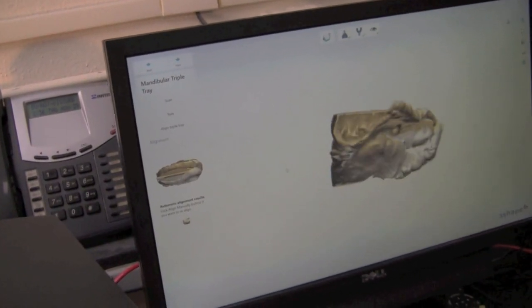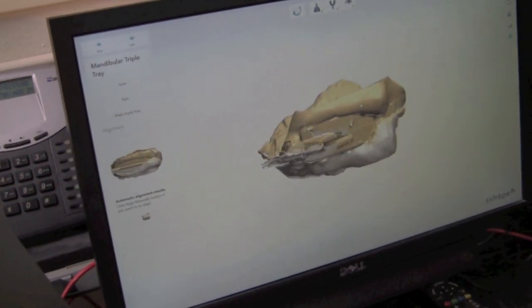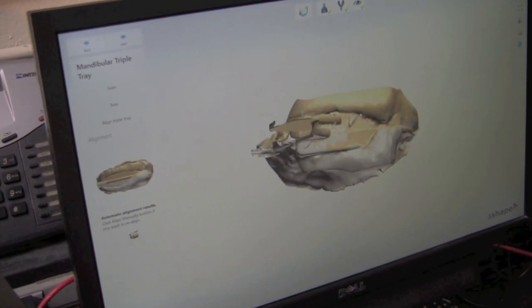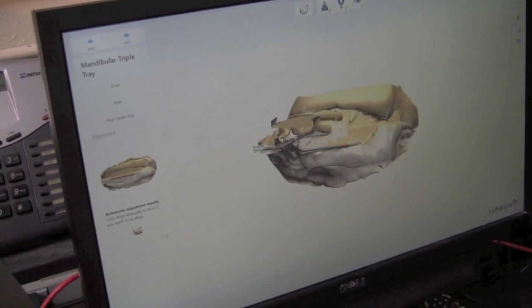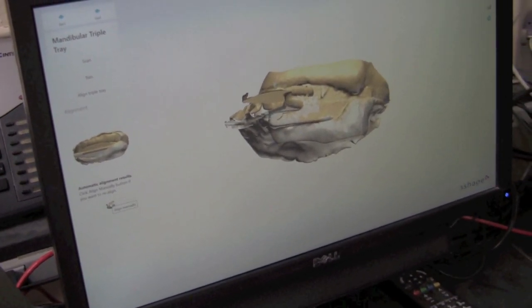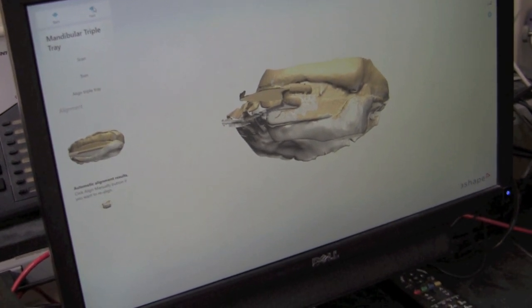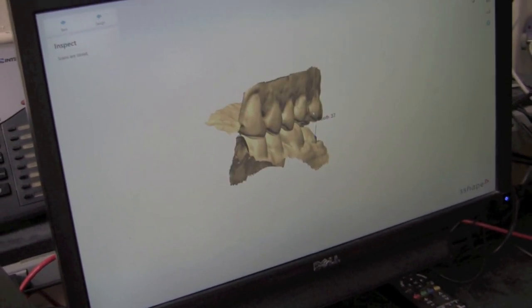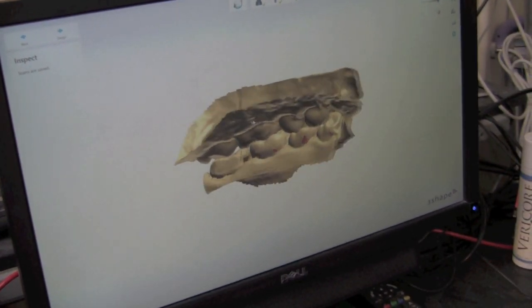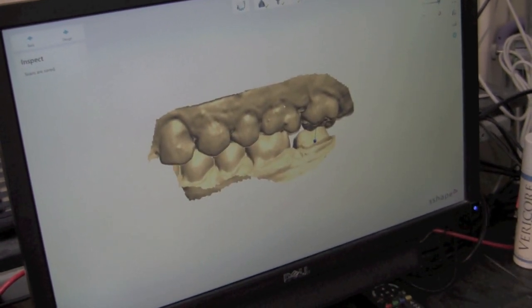It'll ask you to align the triple tray together. As long as you don't move it in the holder, the alignment is usually spot on — which this one is. If it were not, you would just click the icon down here that says Align Manually, and then it would be similar to aligning a bite with points. We'll go ahead and hit Next, and this shows you our end result in the bite. And now it's ready for design.